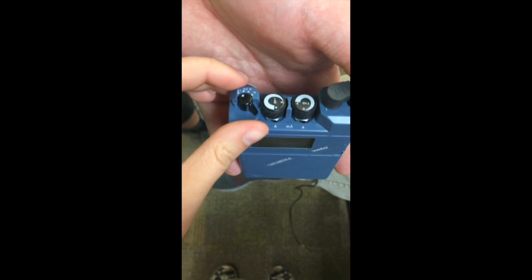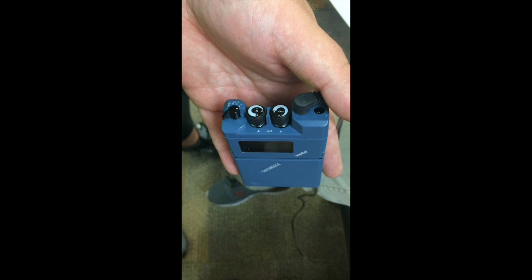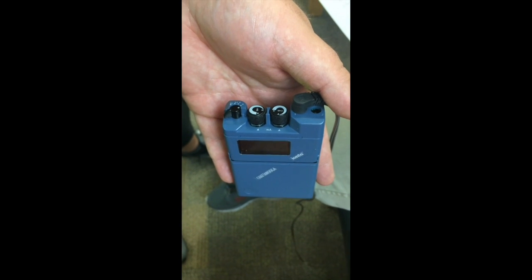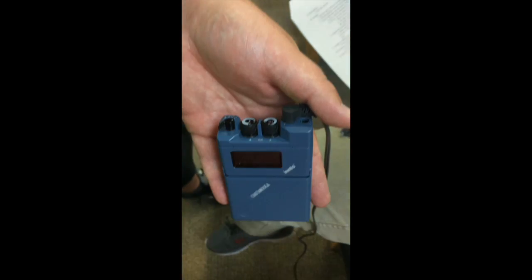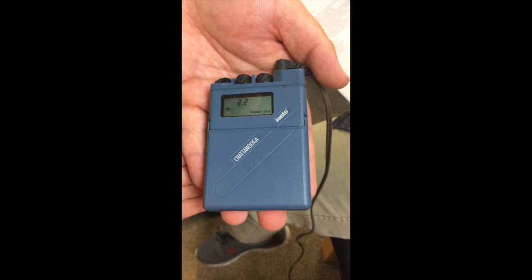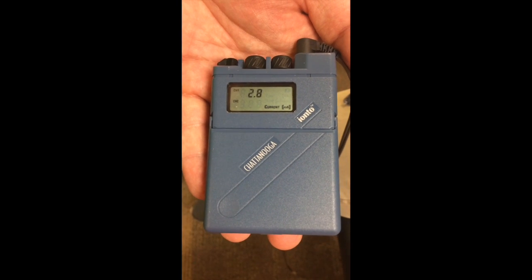Then we'll tell the patient that the treatment is beginning. Then we'll adjust the intensity according to the patient's tolerance and the dosage needed. We'll continue the treatment for 10 minutes.